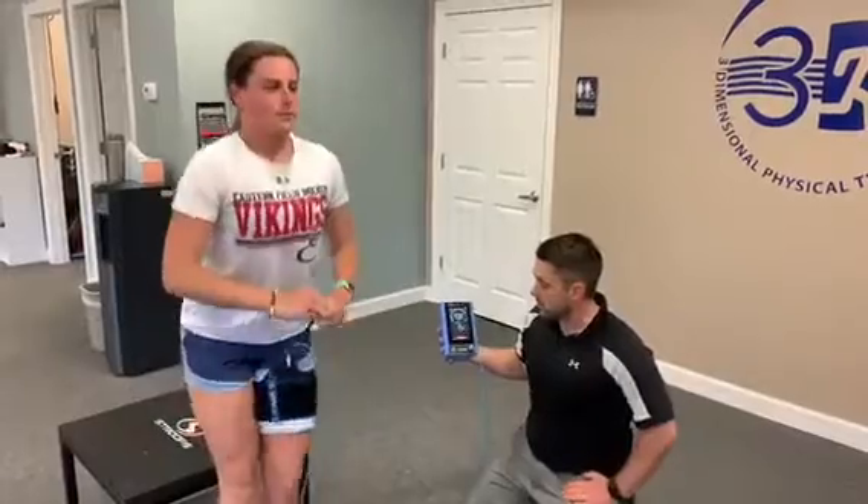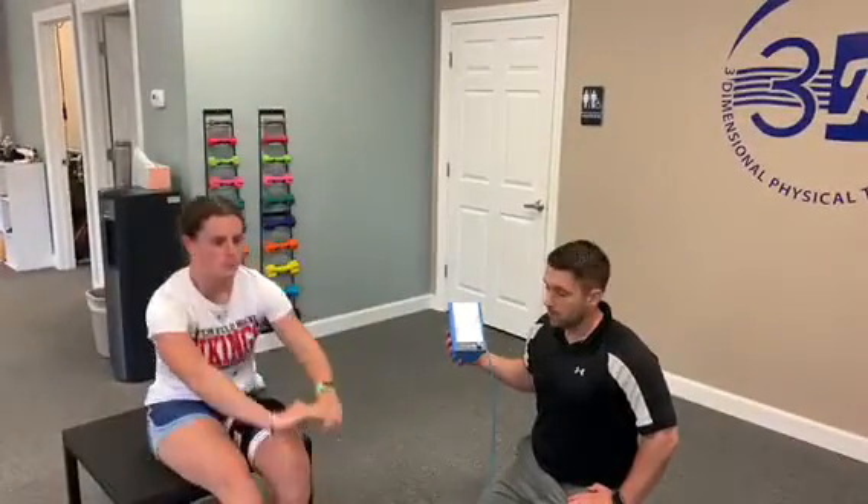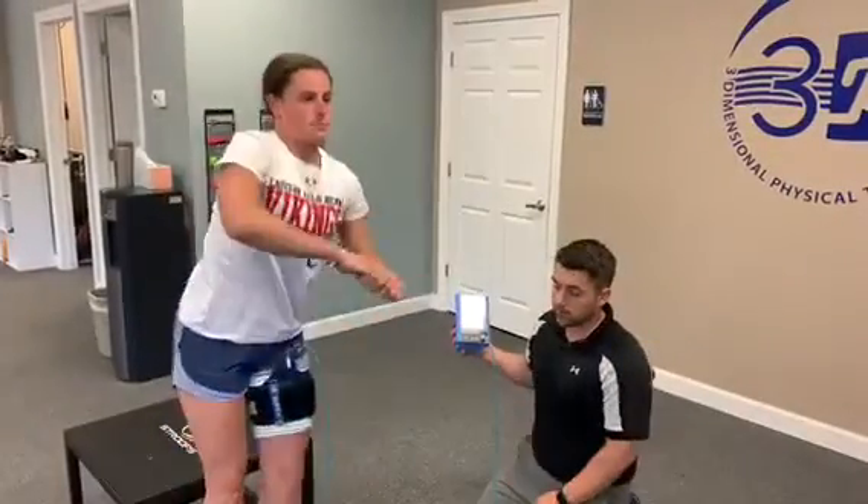Sydney is doing single leg squats with blood flow occluded at 80%. She's going to do her first set of 30, then get a 30-second rest, followed by three more sets of 15 with 30-second rest in between each one. The cuff is going to stay occluded the whole time.